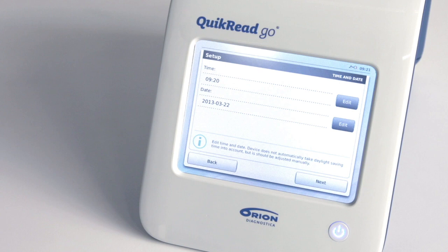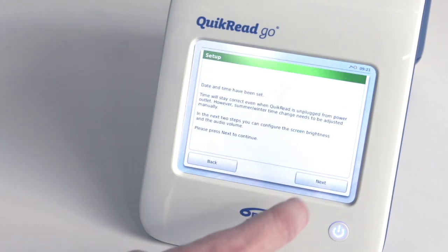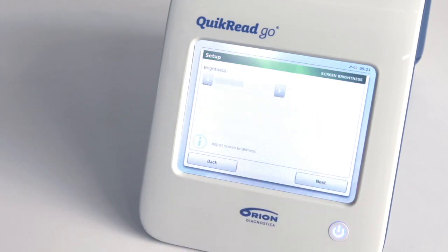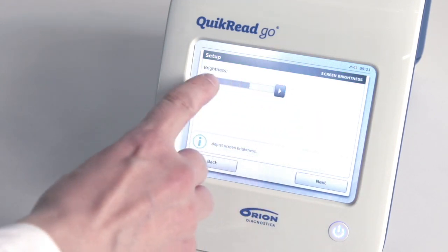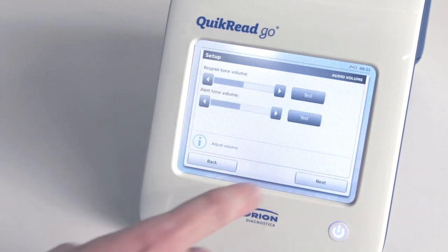Your settings are stored into the memory and will be used every time you start your Quick Read Go. Choose Next to continue. The third step in the setup wizard is to adjust screen brightness. To do this, touch the arrow buttons on the screen. Choose Next to continue.